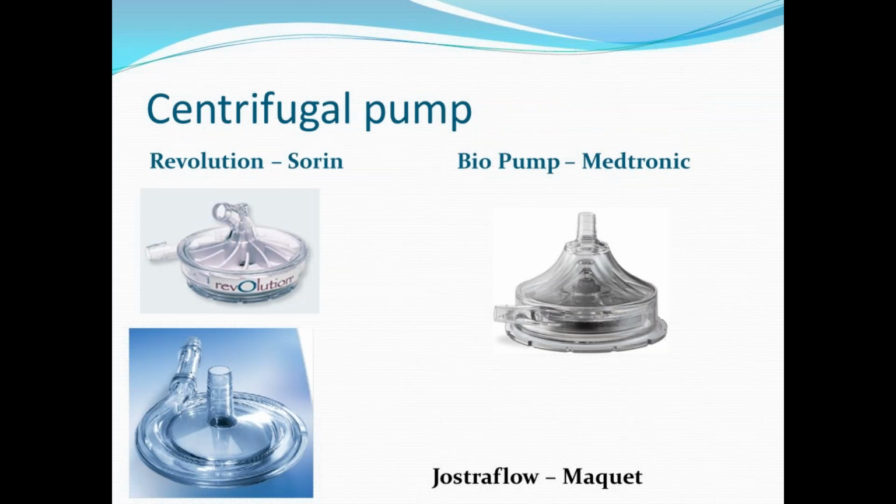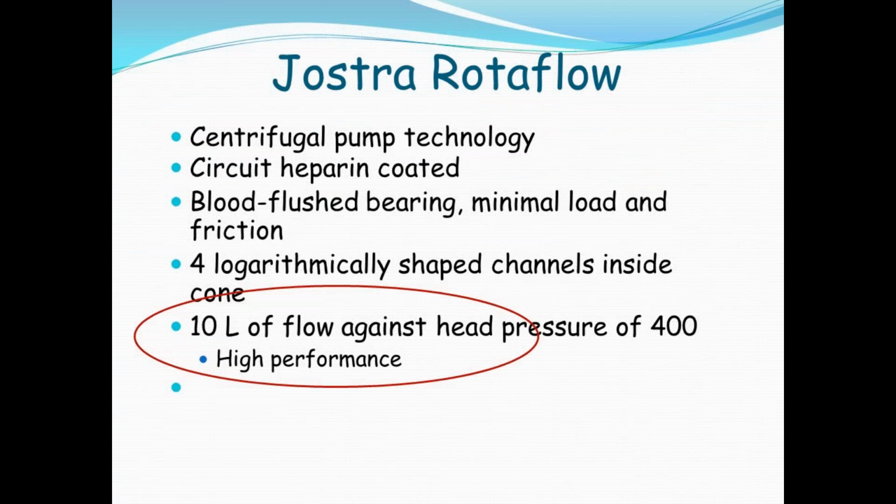Each and every pump has got its own specificity. This pump, Rotaflow, for 10 liters of flow, the priming is 30 ml. And the surface area is less, so your heparin requirement can also decrease. Then the Medtronic one.